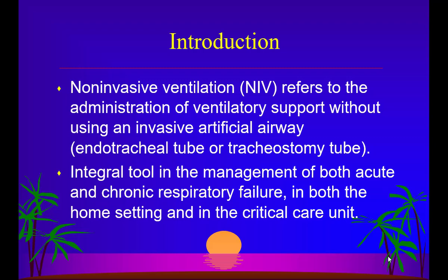The other thing is that it can be applied in various settings. It can be applied in ICUs, in the SDU, in the wards, and it can also be applied in home care. That's the beauty of it. A large number of patients are on non-invasive ventilation at home, and many times even the patient's attendants can be trained in using it. It is very, very simple to use, but it has to be used very appropriately.